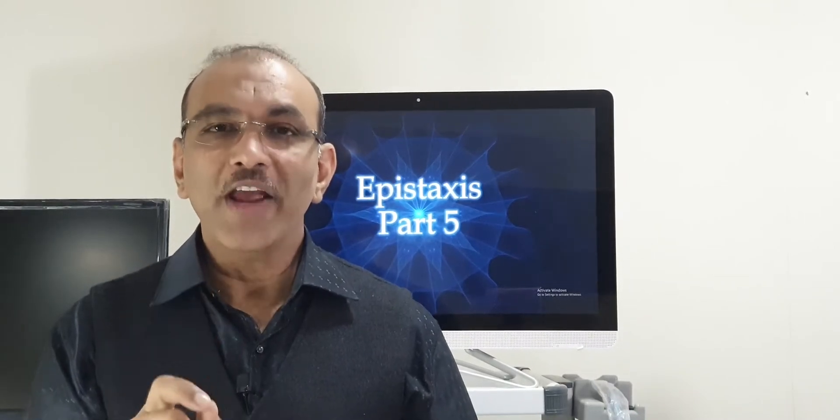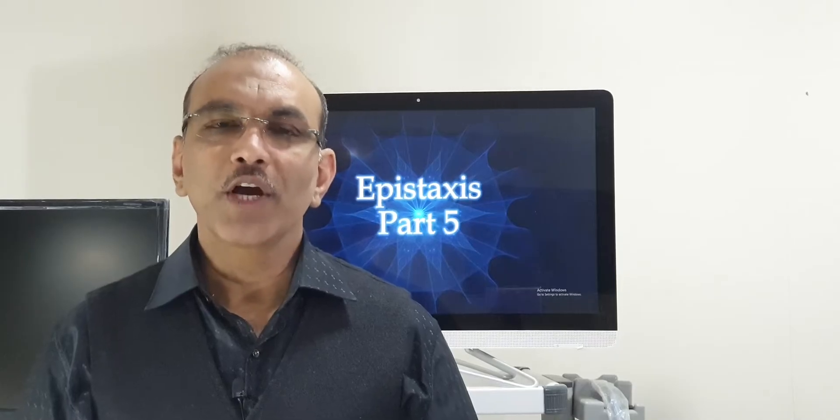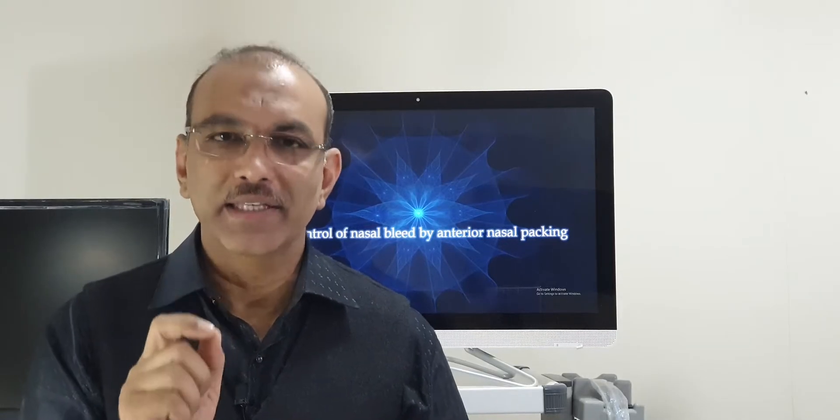This is part 5 of epistaxis. In this video we are going to see how we manage an anterior bleed that is a diffuse bleed with anterior nasal packing.